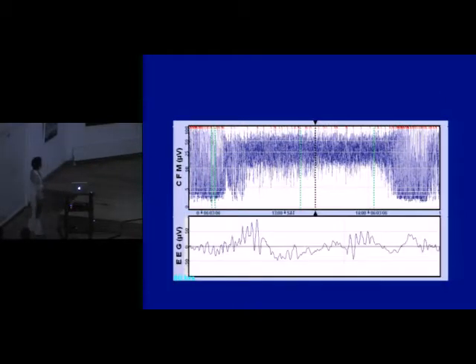And at 60 hours, we had a pattern like this. Is this a normal sleep-wake cycling pattern? So what is this? This looks like burst suppression, this looks like burst suppression, and there's something in between, we don't know. It's a bit difficult if we see only one channel, and we have some sharp waves, but it's very difficult to appreciate whether it is really a seizure or not.